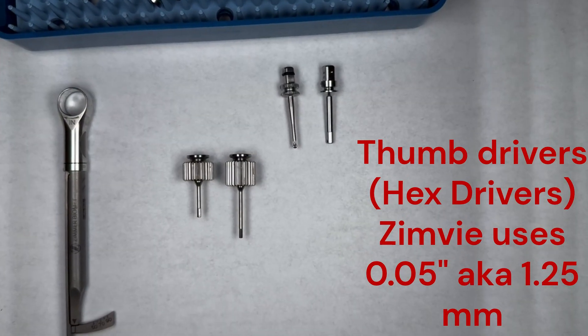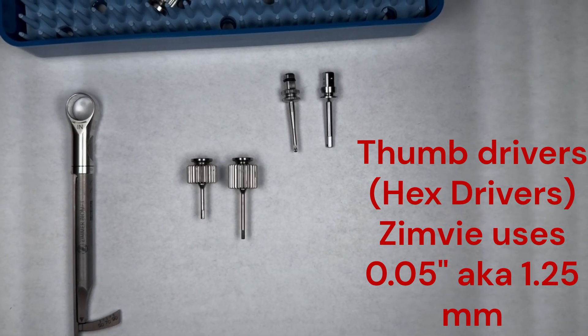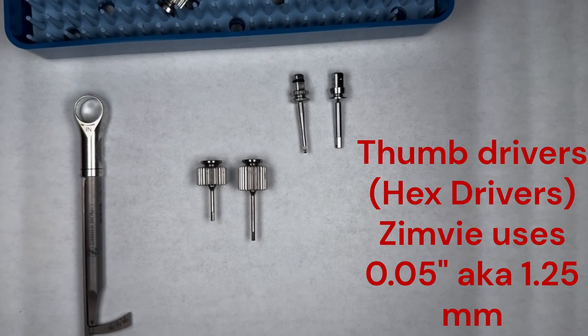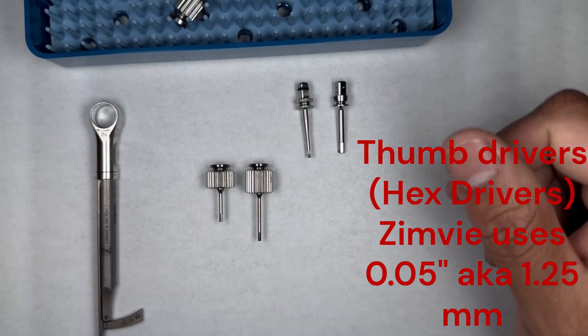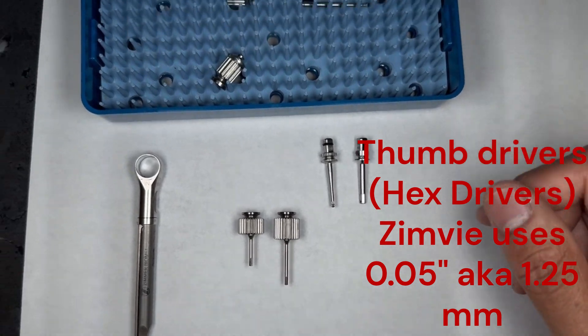Zimmer notably has a connection that's similar to BioHorizons, Astra, and a lot of other systems, which is a 0.050 inch — also known as 1.25 millimeter — hex connection.